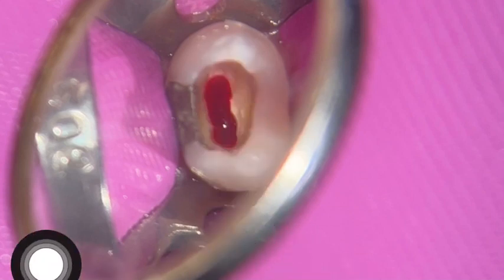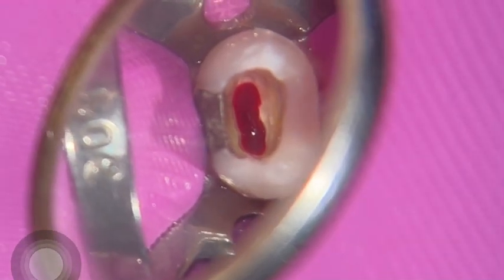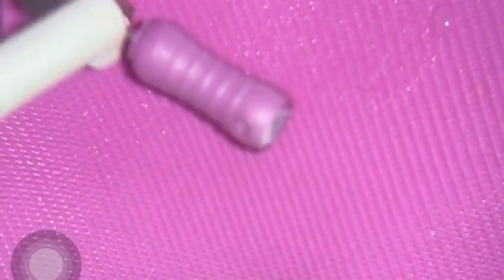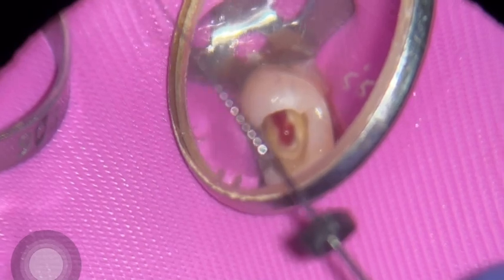We had a hemorrhagic pulp here. What I did before I started recording is I took my SX file and just did a few brushing motions to try to get that coronal part removed so we can reduce that hemorrhage and actually see what I'm doing. After that, I'm going to measure my working length. Initially I can see two canals — buccal and palatal — although I did get a hint of a third canal, so this is what I'm going to be doing here.